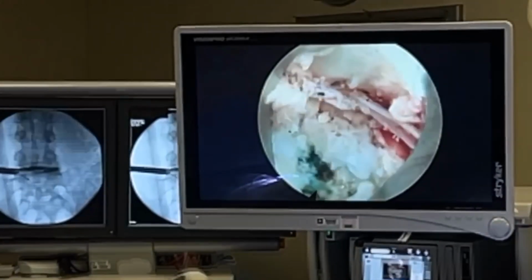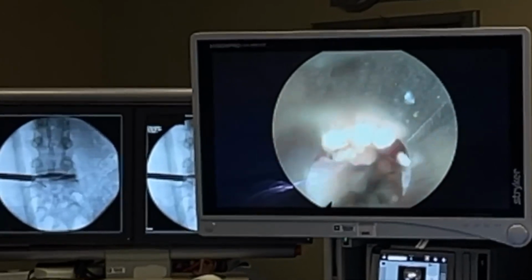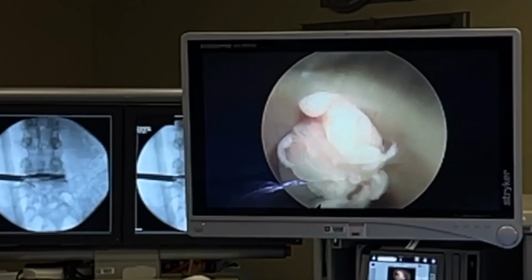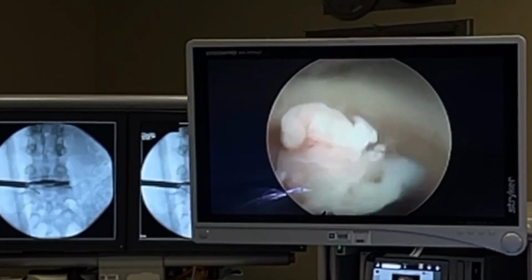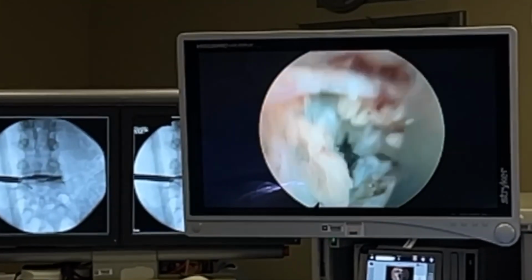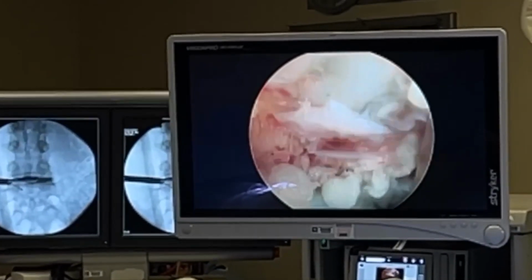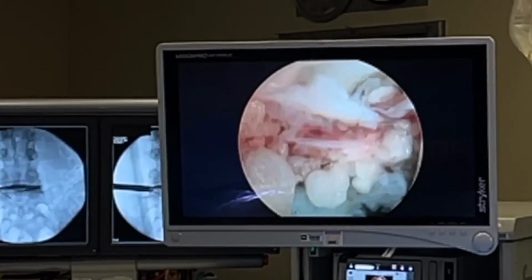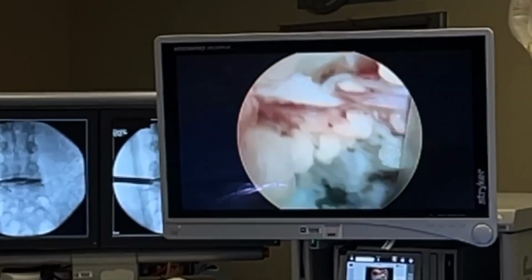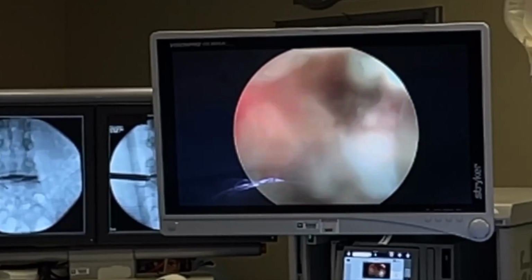Alrighty, I'm all done. You could see where all the inflammation was, but this is where the disc herniation was. I looked all the way around. There's the exiting nerve root. Look away. It's like porn. Can't help but look at it. Inflammation. Oh, I'm very happy. Now I just need to do the radiofrequency ablation, and I'm done. And hopefully, you'll get back to your life and have a great New Year's.